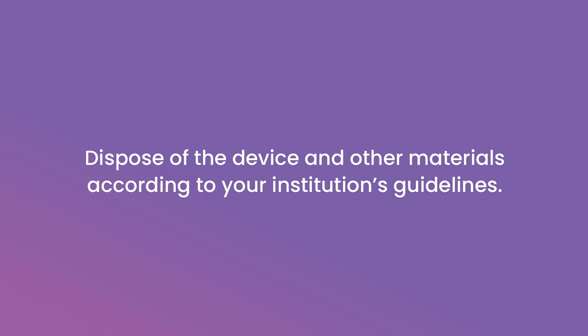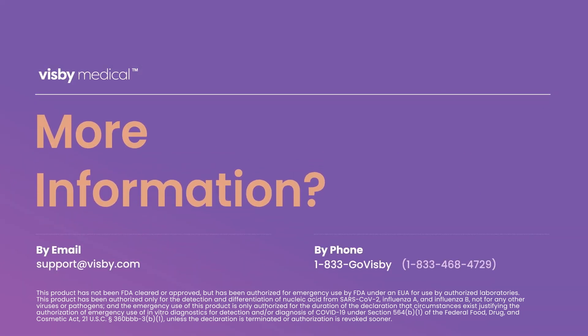Dispose of the device and other materials according to your institution's guidelines. For more information, please see the Visby Medical Respiratory Health Test instructions for use. Contact us directly at support@visby.com or call 1-833-GO-VISBEE for any additional questions or support.